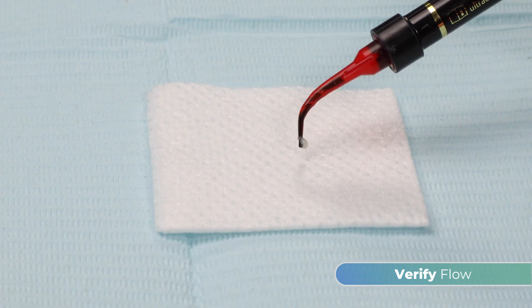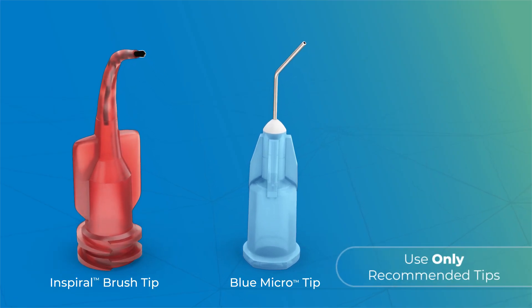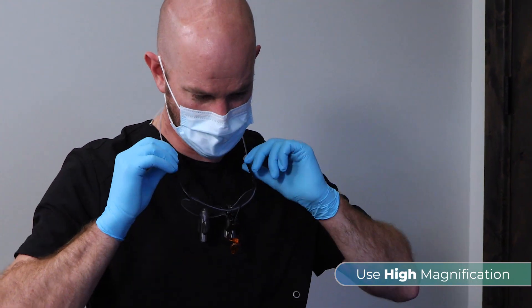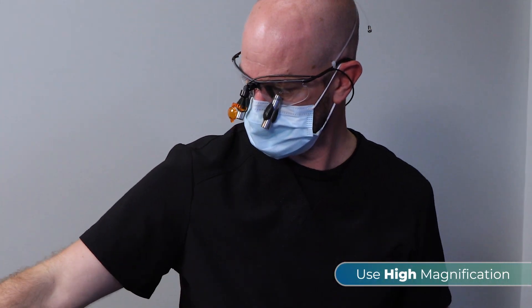If resistance is met, replace the tip then recheck. Be sure to only use recommended tips. To prepare the tooth prior to applying the sealant, use high magnification and one of the following methods.